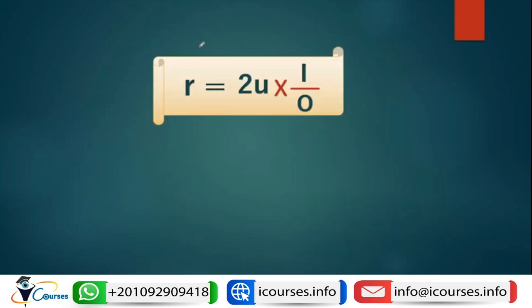And again, the radius of curvature can be calculated by the same equation. So we have a fixed object distance, and we have a fixed image size, but we adjust the distance between the mires, which is the object size.